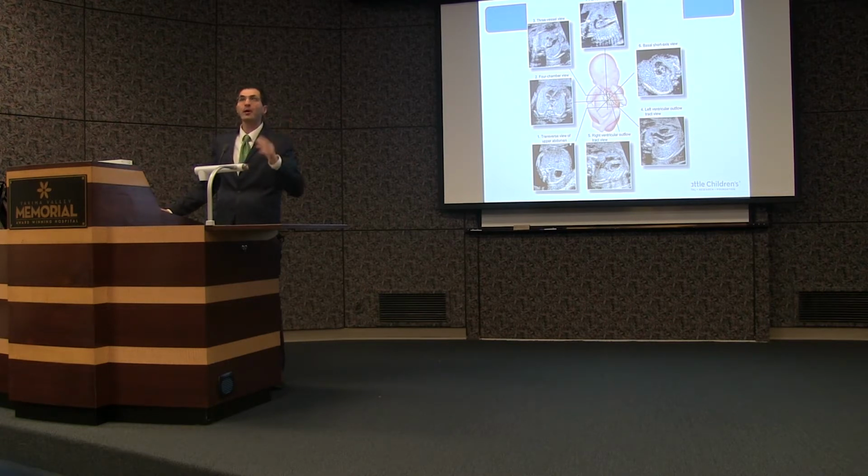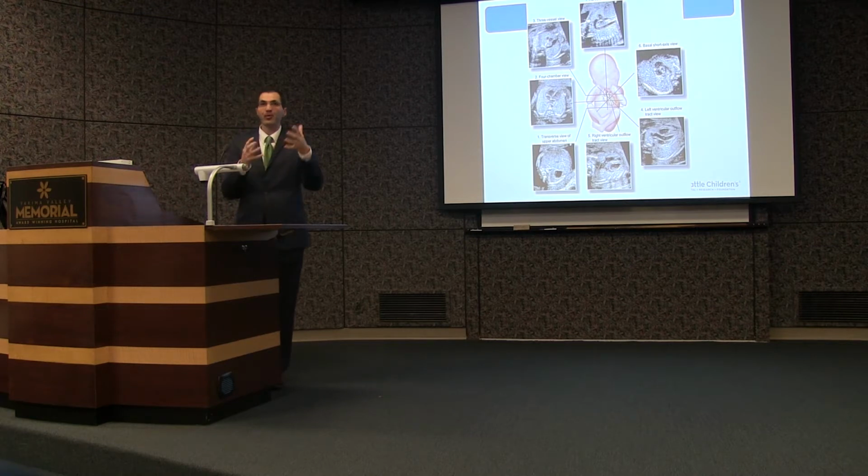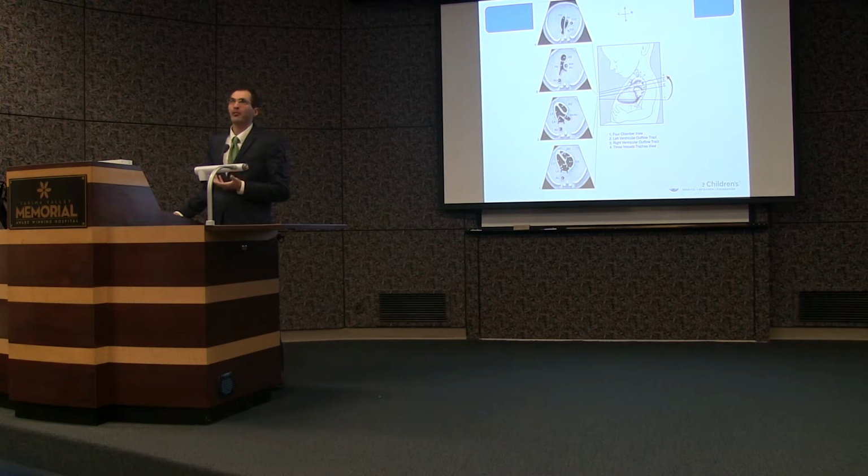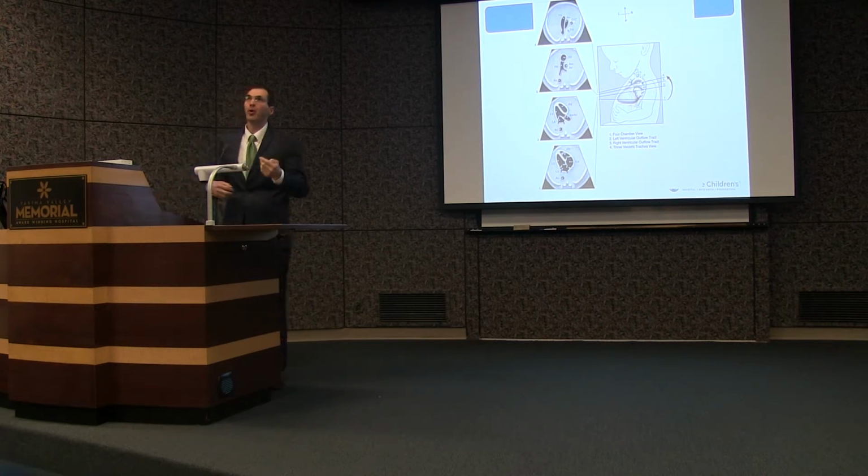sweep through the baby's heart, it's a little more challenging in fetal life because they can be in any three-dimensional space. These are some more focused examples of the same thing, illustrating the sweeps. And so here is a classic 4-chamber. But as you take your transducer and gradually sweep in an anterior direction, now you're starting to expose one of the outflow tracts. And then you're getting one of the other outflow tracts, and this is what we call the 3-vessel trachea view. And the 3 vessels are going to be your superior vena cava, your aorta, and your pulmonary artery.